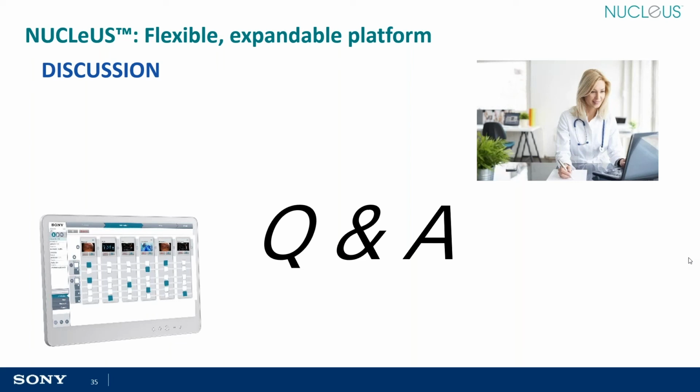Okay. Or lighting is controlled through a tablet. Can you sync this all so only a single tablet is used, making it easier to use by nurses? The basic answer is yes. NUCLEUS is just web browser based. It's just a URL. As long as we can browse to that lighting control, then yes, we can control it and bring it into the user interface. If you want to get even slicker than that, you can create your own API. But with the basic NUCLEUS out of the box, as long as we can reach that through the network, we can also control the lighting through NUCLEUS.